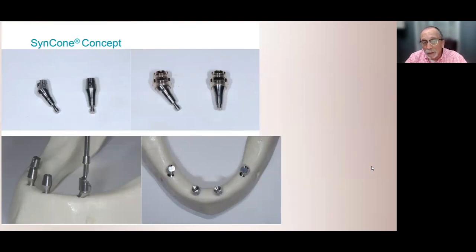So we did some of these, but not many, because again, implant placement can be tough, especially in the posterior, to get that angle exactly that we needed. And if they're not perfectly parallel, we ran into problems. But it was a genius concept, and when it worked, it worked great. And I remember doing one with one surgeon, and he fell so in love with it that we started doing them more and more, and we were fairly successful.